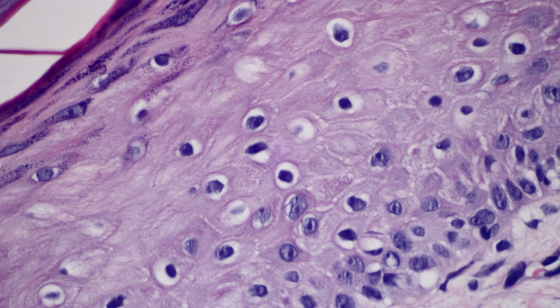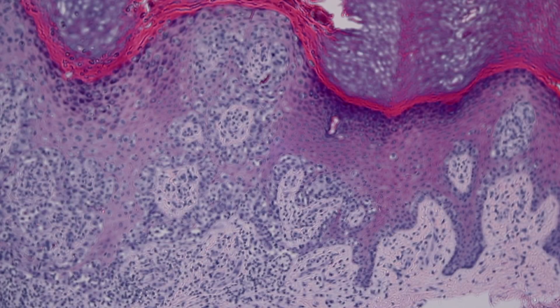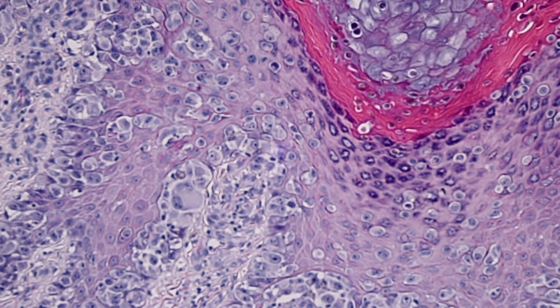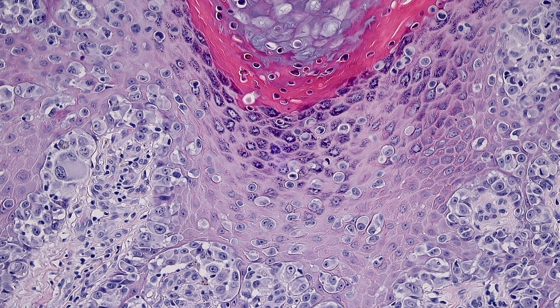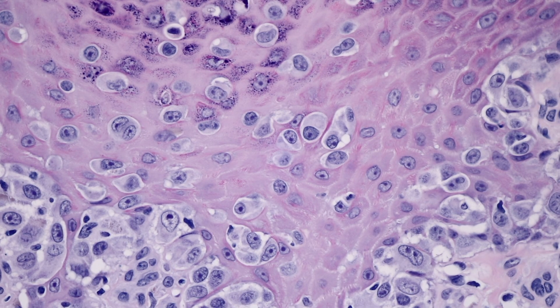All of those clear vacuolated cells you're seeing here are all artifactual vacuolation around keratinocytes - a really useful pattern to recognize. Here's another area from the same biopsy - again, all of those are keratinocytes. Now let me switch to a different case. This is an example of an acrolentiginous melanoma. Acral melanomas often have dramatic pagetoid spread, and look at all of these big, ugly cells.